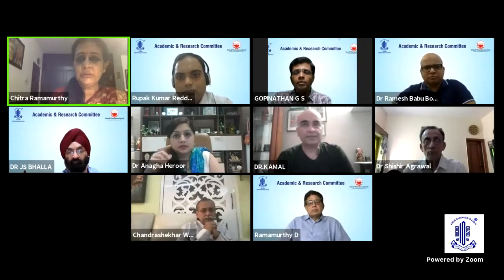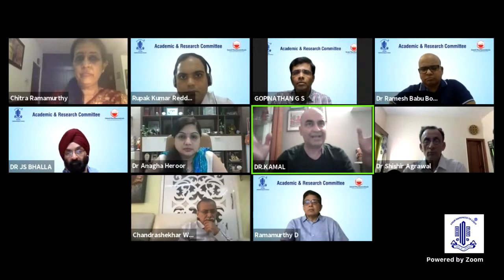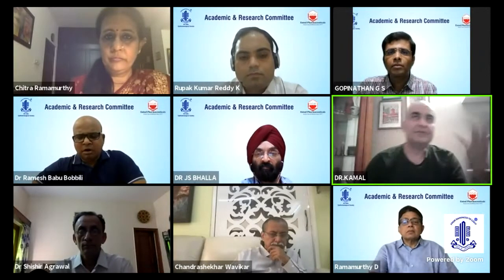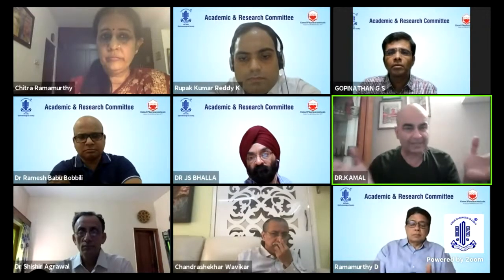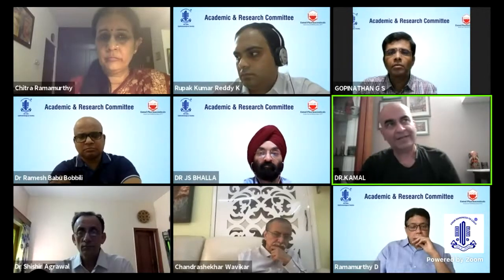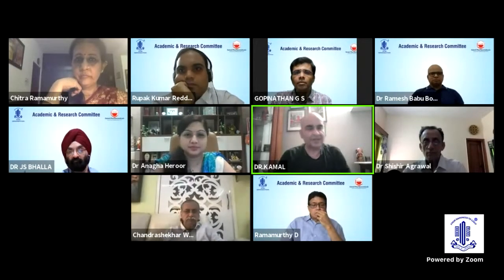Dr. Kamal, you want to add something? I actually feel that what you're saying is right. Putting the CTR can be delayed, but not as delayed as putting the lens, because once you have taken care of everything inside the bag, the bag has a tendency to collapse on its own. Then the chances of having an extension of the zonular breakdown increase, with vitreous potentially creeping into the anterior chamber. An ideal time to place it would be when you still have a cortical plate or some cortex remaining. But once you clean the whole bag, then putting the lens and then the CTR ring is a bit tricky. And injecting triamcinolone to check for vitreous in the anterior chamber probably has to be done in the earlier part of the surgery.